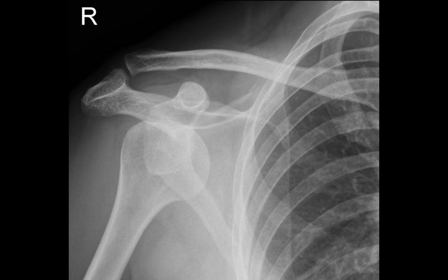And finally, what's the abnormality of this shoulder? It's another anterior dislocation.